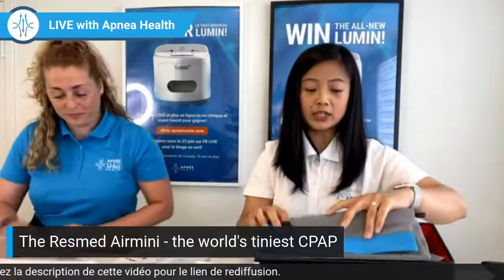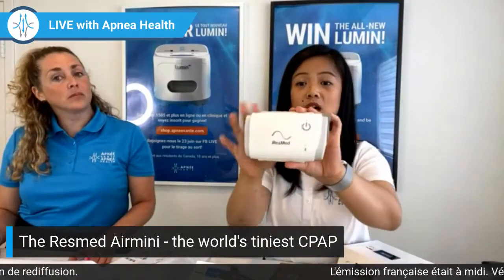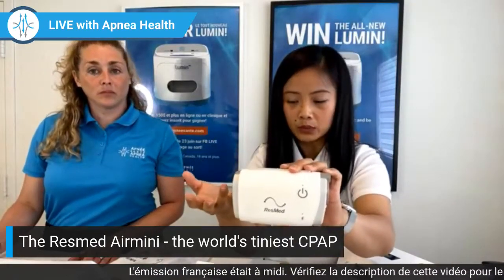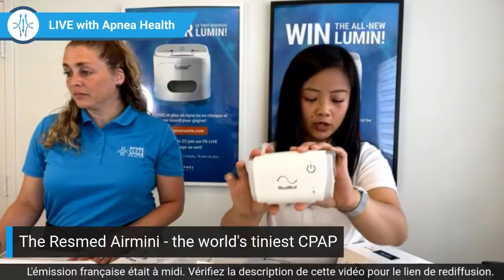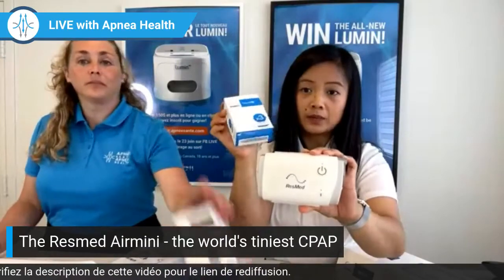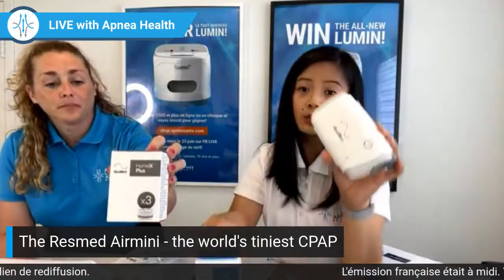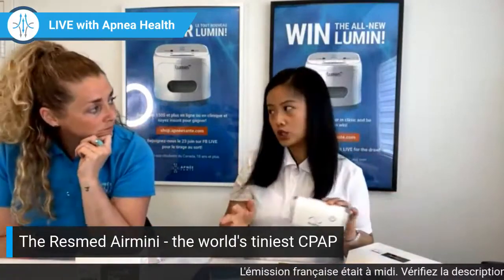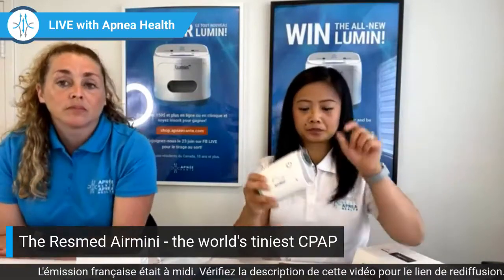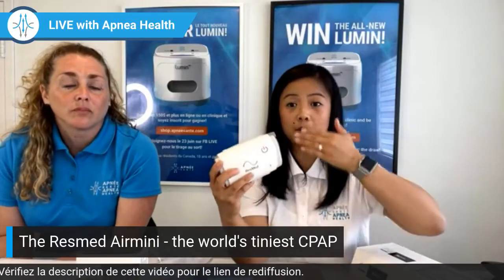So you'll notice that the reason why the Airmini is so light and so tiny is that it's not equipped with a heated humidifier like a home CPAP would be. Instead of a heated humidifier, it comes with a puck or a filter. It's actually called the Humidex or the Humidex Plus. In the medical world, it's known as a heat and moisture exchanger, HME. How that works is that little puck or HME filter is in line, so it's between the patient and the CPAP.